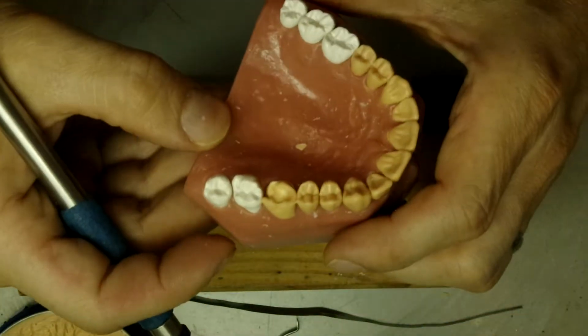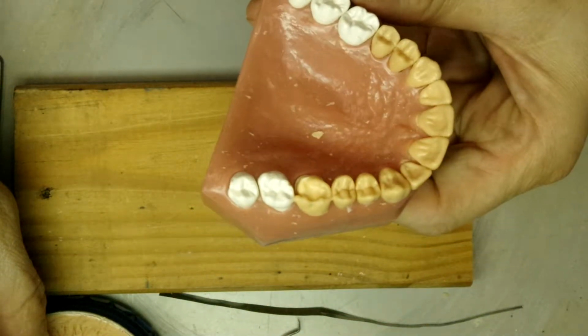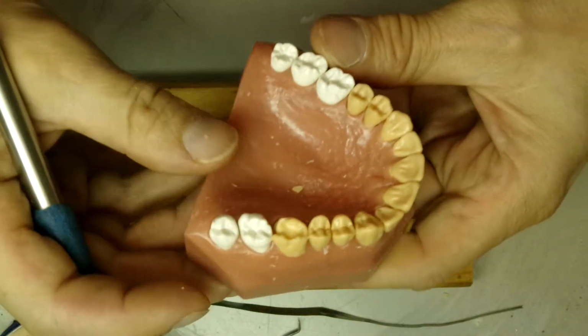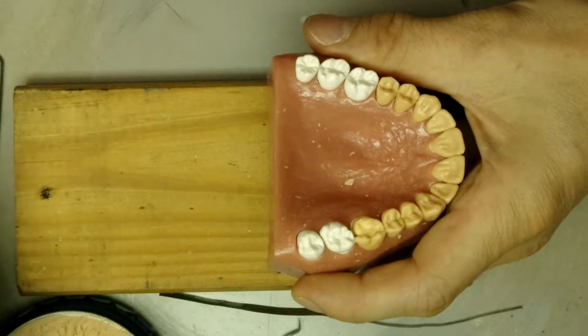Just like that. Then we're gonna do the distal cusp.